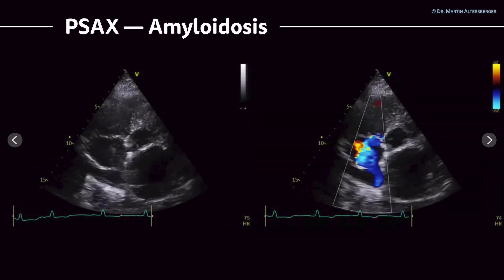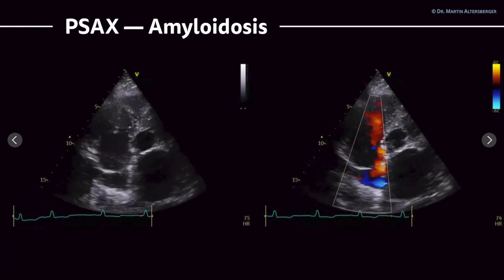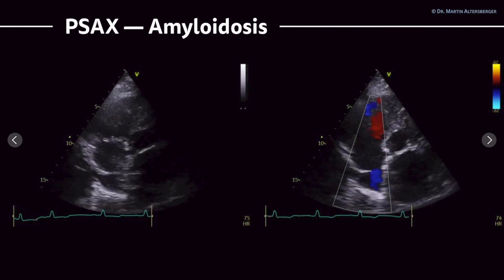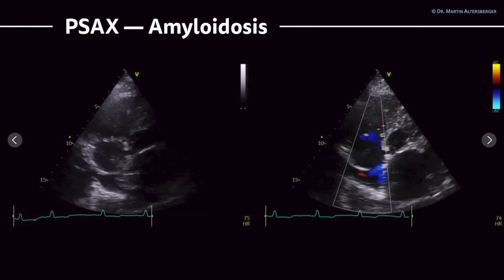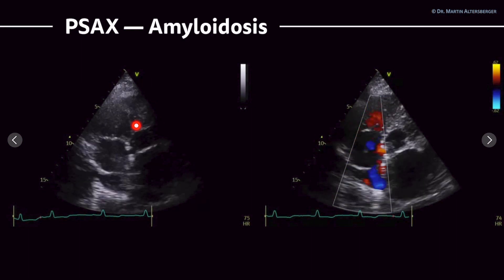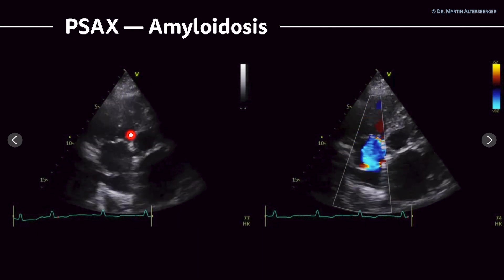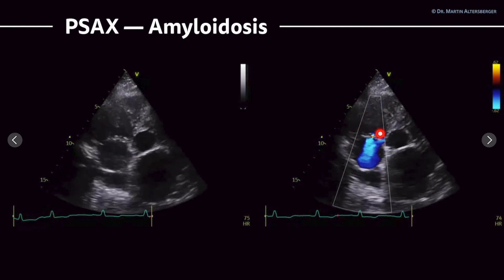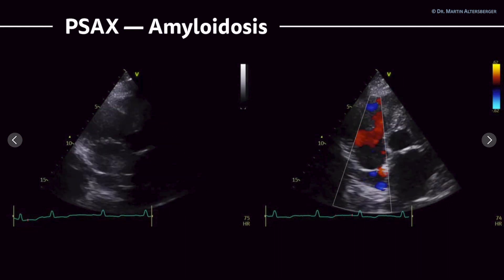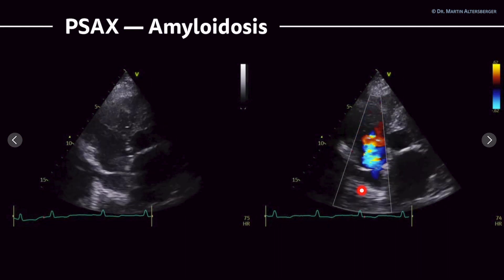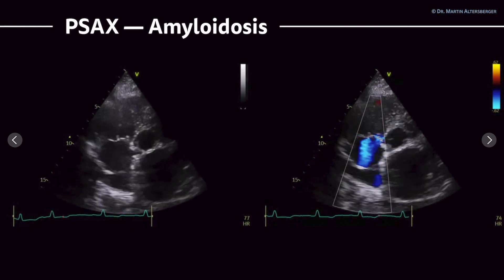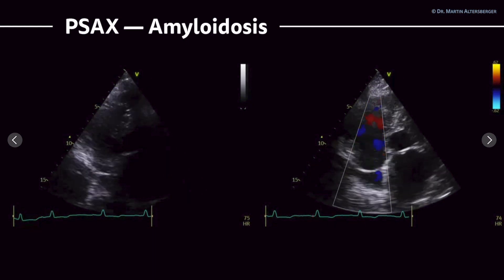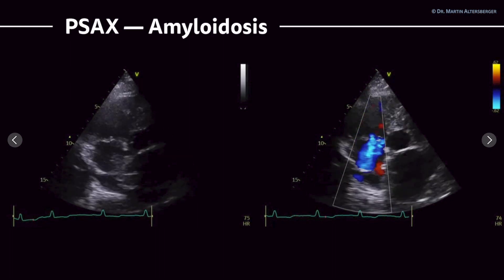All these views are important to display pathology, especially involving the tricuspid valve — we can visualize tricuspid regurgitation or other valve pathologies. For example, in a patient with amyloid heart disease, the left ventricle is visibly thickened and the tricuspid valve also appears thickened. Color Doppler shows probable moderate tricuspid regurgitation. With color Doppler misalignment corrected, continuous wave Doppler can be used to estimate systolic pulmonary arterial pressures.